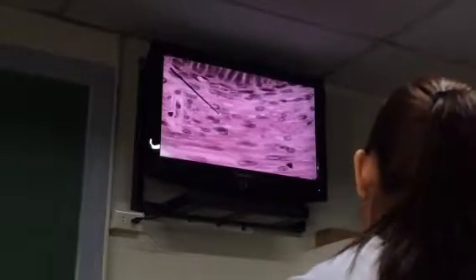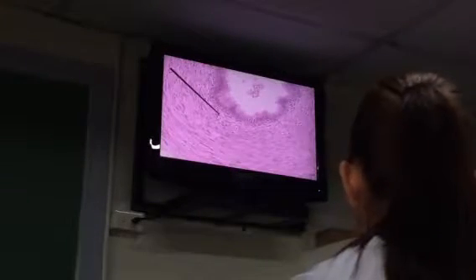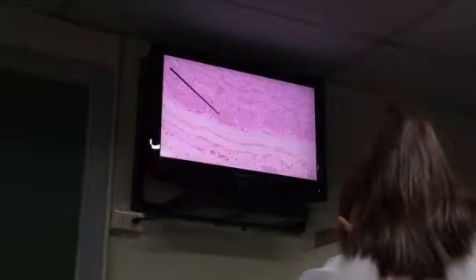Now, regarding this muscle layer, it is of 3 sublayers. Your tunica muscularis is of 3 sublayers: inner longitudinal, middle circular, outer longitudinal. So quite thick. We will not ask you to identify which is inner, which is middle, and which is outer. Sufficient to say that there are 3 layers of muscle tissue, smooth muscles at that, and the outermost layer again is of course tunica adventitia.